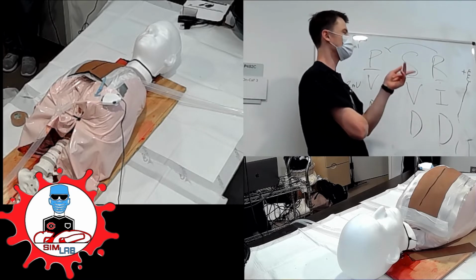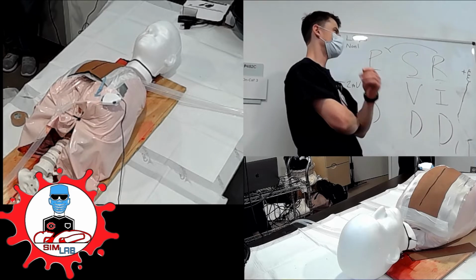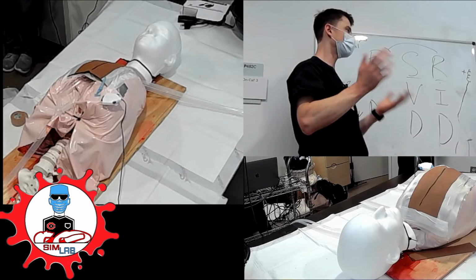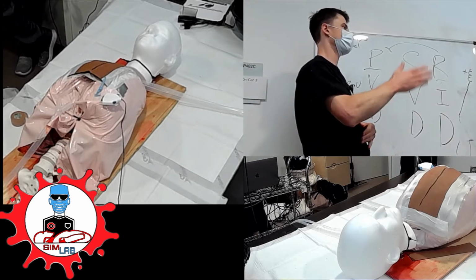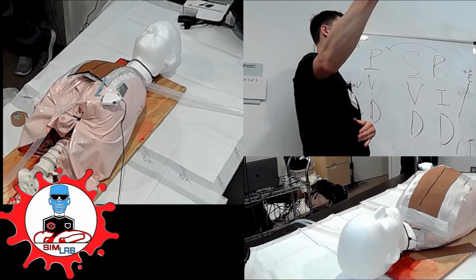So that's the safest way to do it. You just turn the rate down, and then you can turn it back up. If you see people unplug it, do the pause button, turn it off, all those things, it's rare, right? Most of the time they find the rhythm back, but there's a chance that you could lose the rhythm. So the safest way to do that is to turn the paced rate down until you see what their rhythm is.